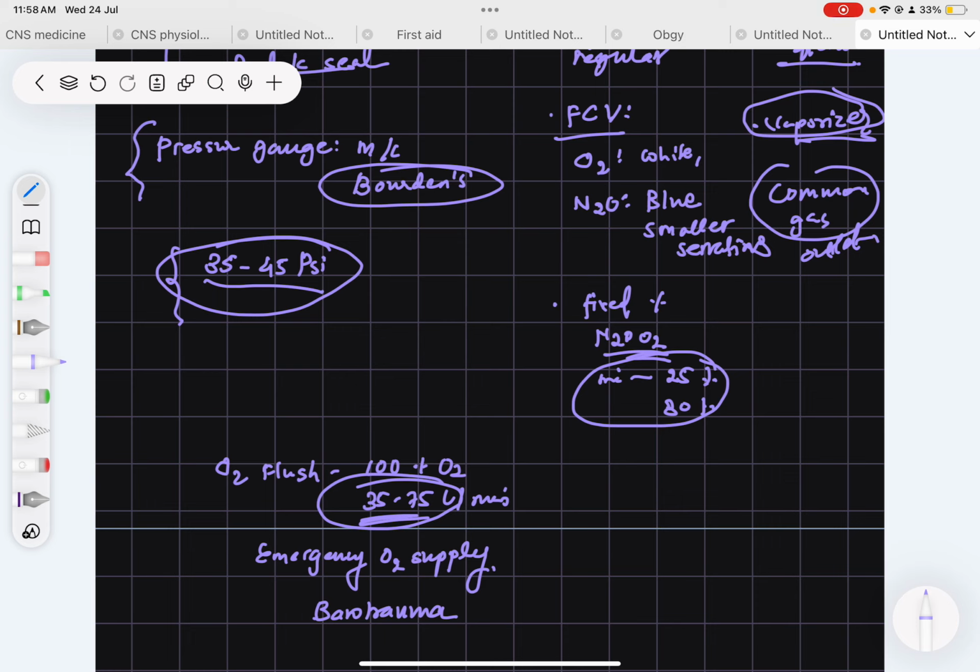First we have to give the anesthesia, and we are learning about this now that we have prepared the patient, and done all the mandatory processes required before the surgery.